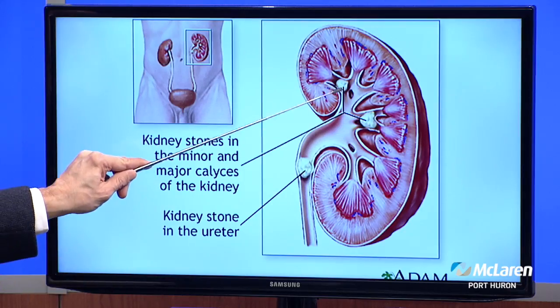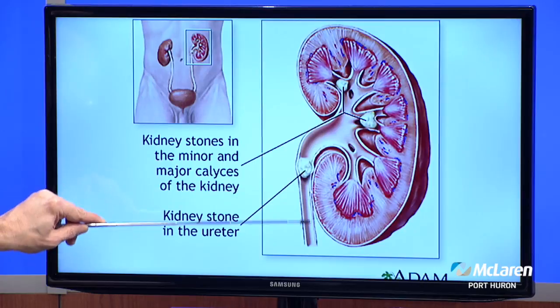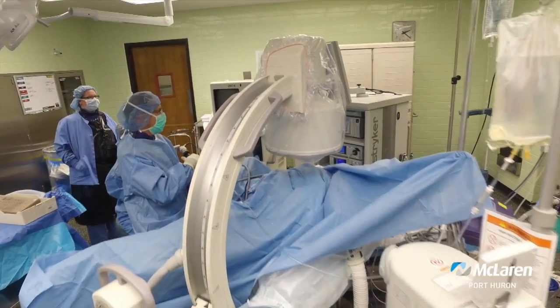All right. Well, speaking of laser, tell me about the holmium laser then. So the holmium laser is a glass fiber that can be passed through a scope. It transmits holmium laser energy, and holmium laser energy breaks stones up. The trick with ESWL is hoping that the shock waves will effectively break up the stone. The likelihood that the stone will break up with ESWL is 70 to 75%. With the holmium laser, if you get the holmium laser up to the stone, the chances of the stone breaking up are 100%. So the trick there isn't the effectiveness of the laser, it's being able to get to the stone. For that situation, you pass the scope up into the bladder, up the ureter, up to where the stone is. So we'd pass the scope right up to that area.